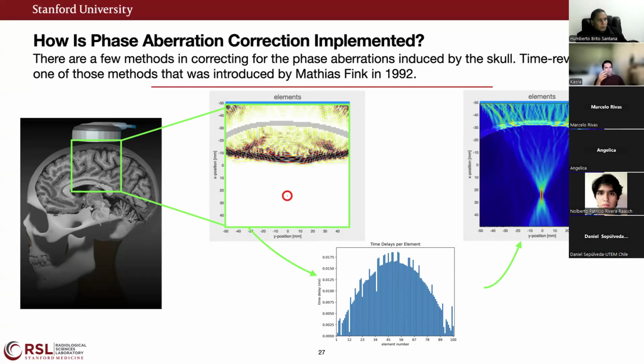If we do this, the problem is that because this is based on the physics of the problem, we are still tied down to that trade-off that I mentioned earlier, trade-off between efficiency and accuracy. If we want to improve efficiency here, for example, if you want to run this on a much finer spatial resolution, simulation runtime is going to be a lot longer.